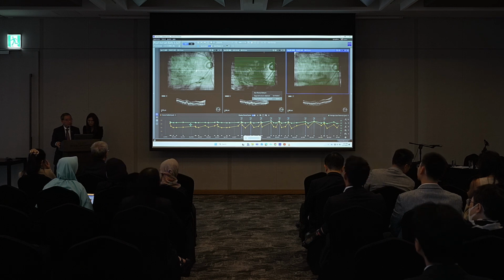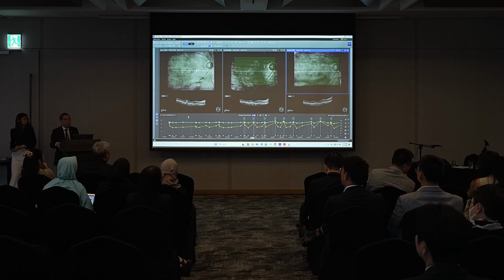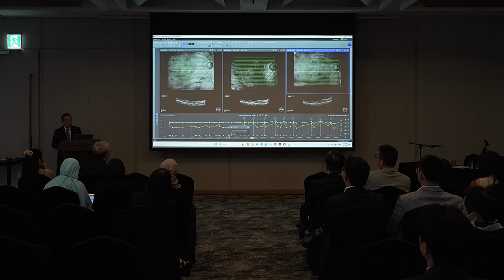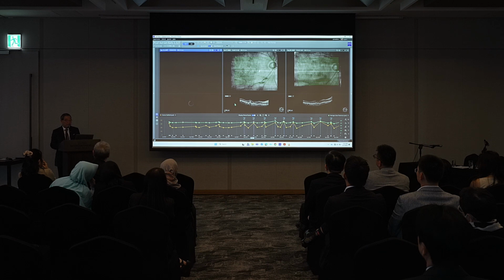All right? So you'll see that the last two, the middle and the rightmost panels, refer to the current visit as well as the penultimate visit, the prior visit. You can always modify it. For example, if I want a particular event I want to show, I will drag that event into whichever window that I want. Why is this important?